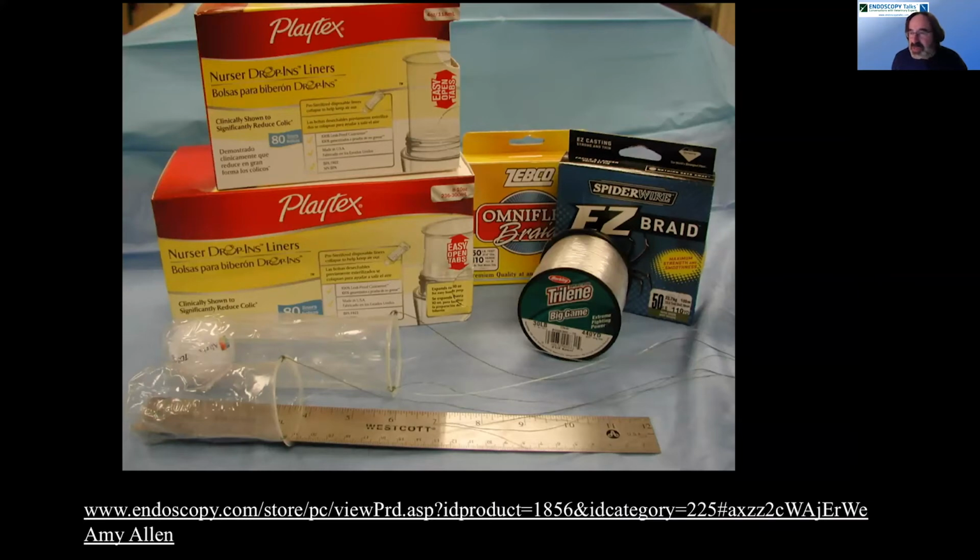Briefly, I want to mention that some people who do not have the large baskets make their own with baby bottle liners. You could attach fishing line to them, and these can be manipulated in the stomach, or the dog's position can be altered, and you can scoop up the large foreign body and then pull on the fishing line. I have a reference listed here from the internet from a veterinary internist who has a very nice description on how you can make these and have them available if you think they'll be helpful in your practice.